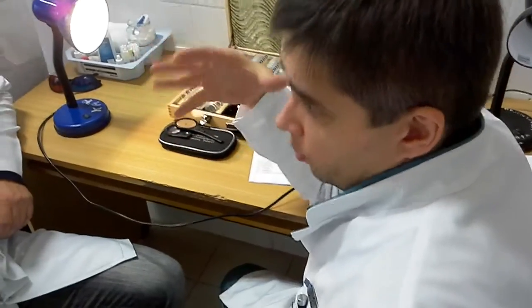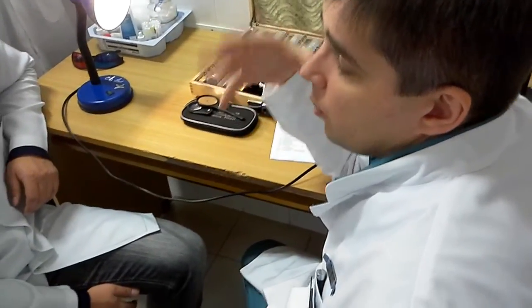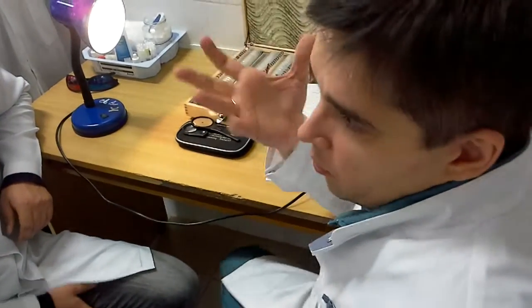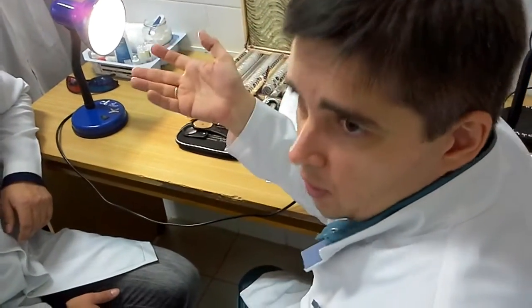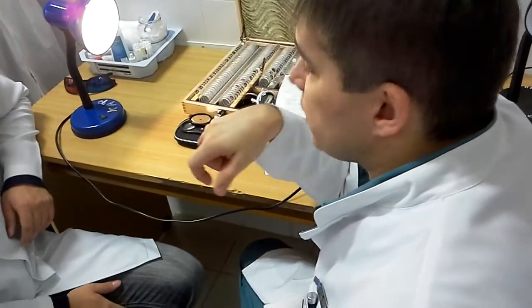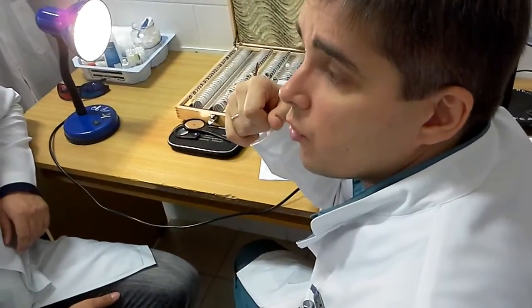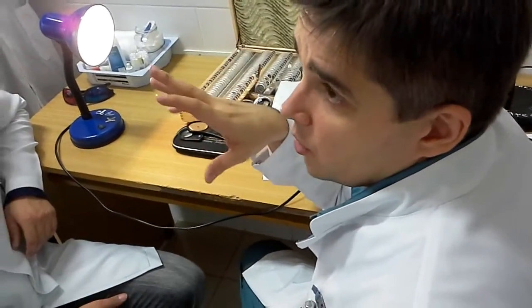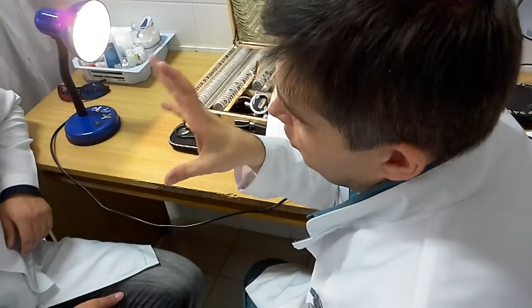Without ultrasound, without other severe equipment, with our modern equipment, we can't see because it's an opaque lens: no red reflex, no fundus examination, and so on. And for the prognosis, this test was very important. If your patient has cataract, there will be correct light projection. No vision, but correct light projection of the case.